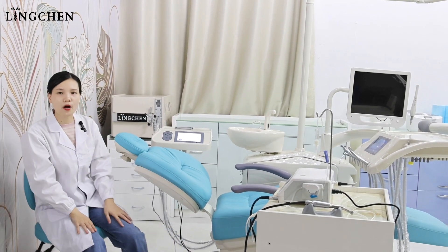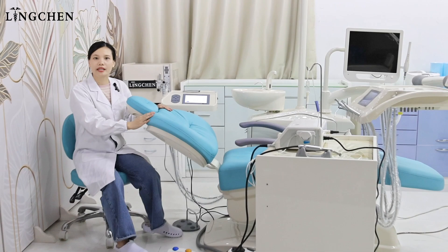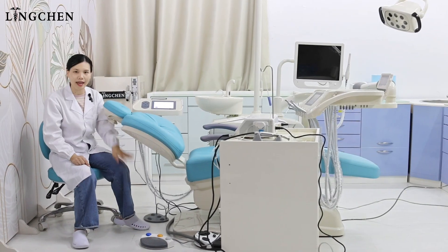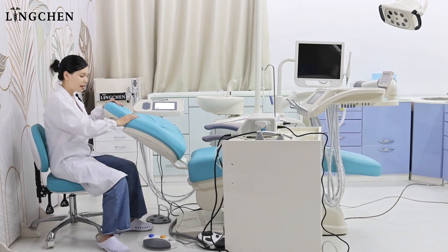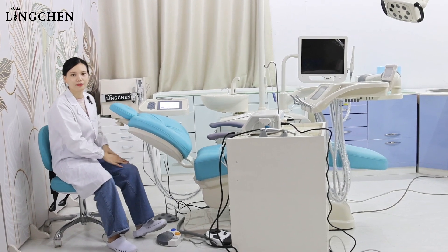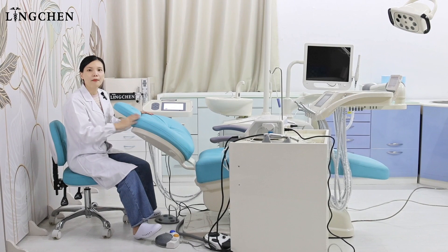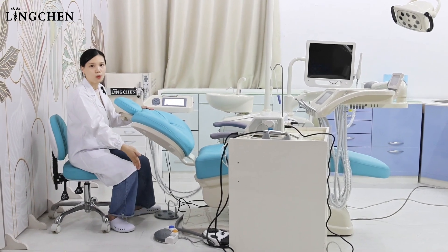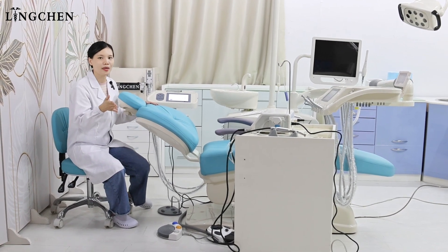The next point is about the foot pedal. Normally for the dentist working, he works with his left leg. But because of the limitation, it's not easy for him to reach the foot pedal with his left leg. So he will feel uncomfortable using the right leg on the foot pedal. This is another conflict point for the traditional implant.